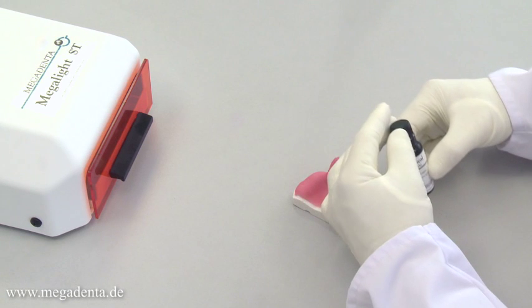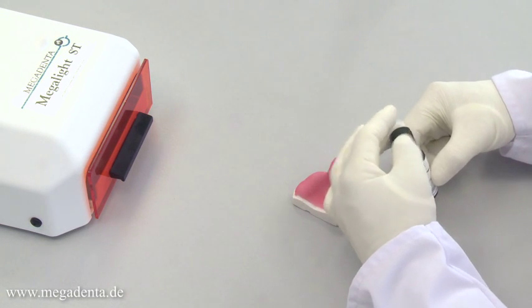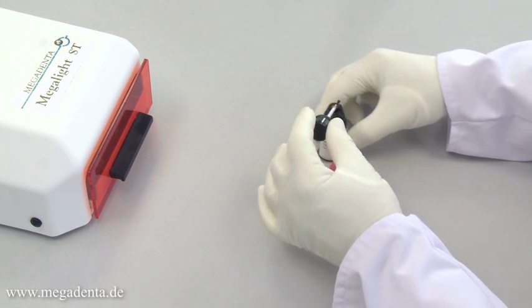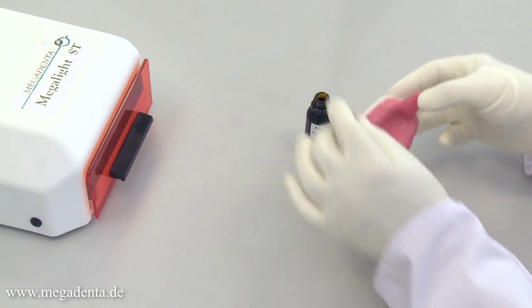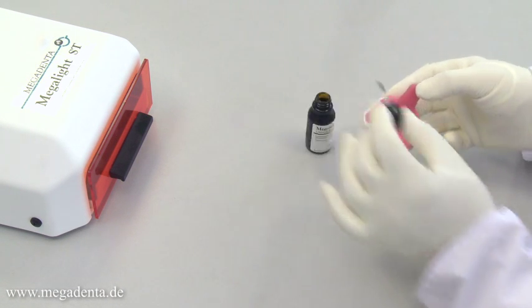The surface of the tray can be glazed with Megaseal, the light curing brilliant lacquer. Megaseal is applied with a brush in a thin layer and cured in the same light curing device for three to five minutes.